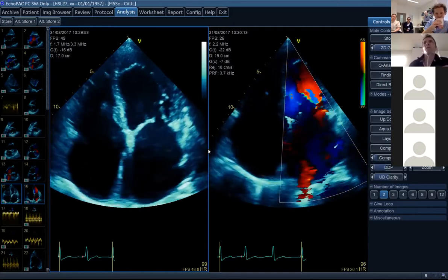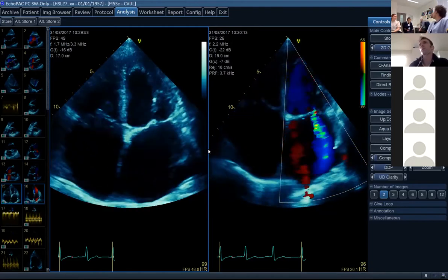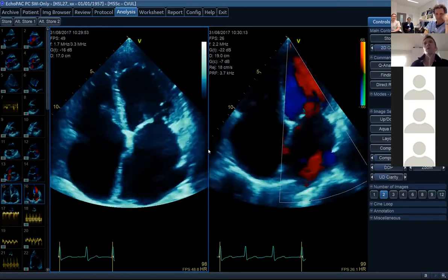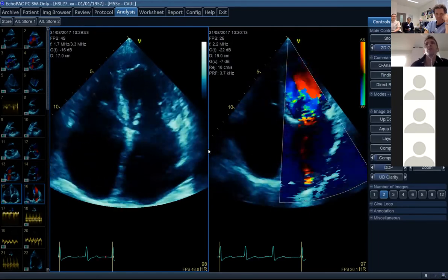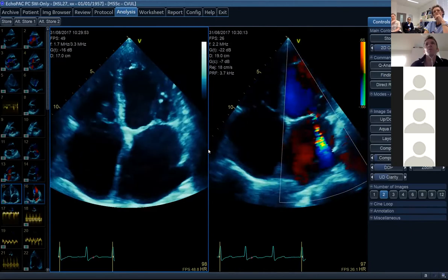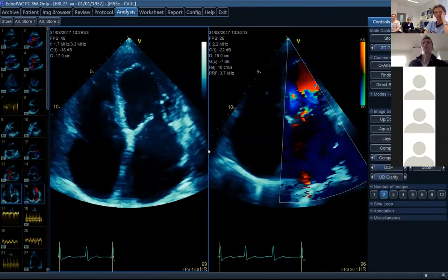So there's an apical four-chamber view. The dual screen with some color on the right-hand side with a scale that looks appropriate. Unfortunately, clips play a little bit slow for me. So the outstanding features are this very large biatrial enlargement. The intra-atrial septum maybe is a little bit bowed to the right side. Excellent.